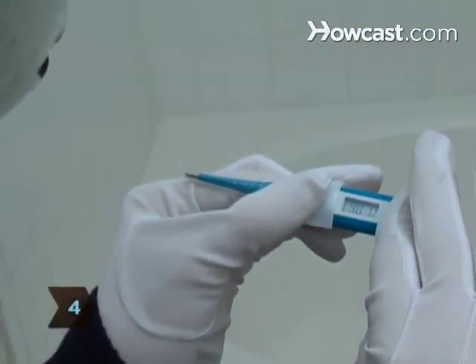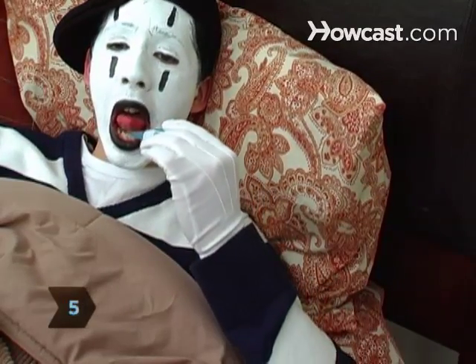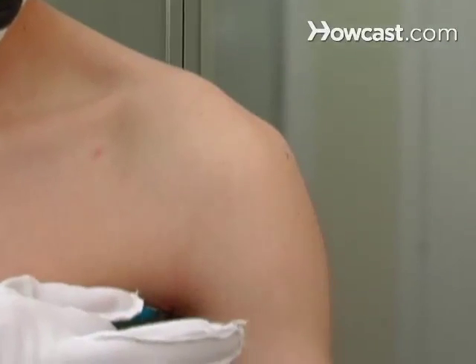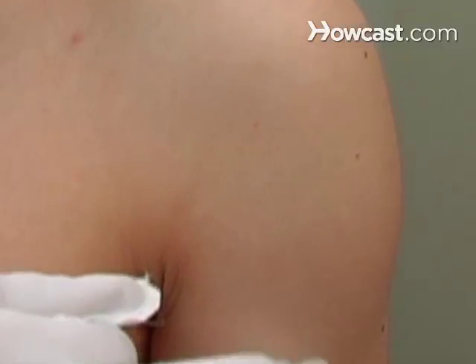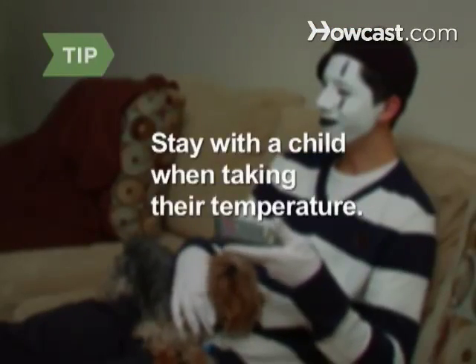Step 4. Turn on the thermometer and clear it of any old readings. Step 5. Insert the thermometer into your mouth and press your lips together for an oral reading. For an armpit reading, remove your shirt, place the thermometer high into the center of your armpit, and press your arm tightly to your side. Stay with a child when taking their temperature to make sure they stay still.